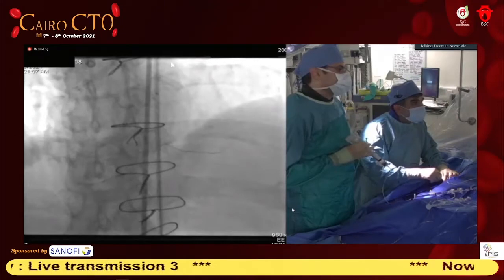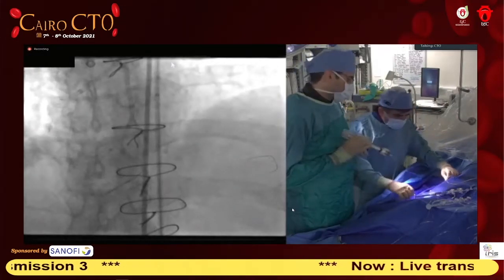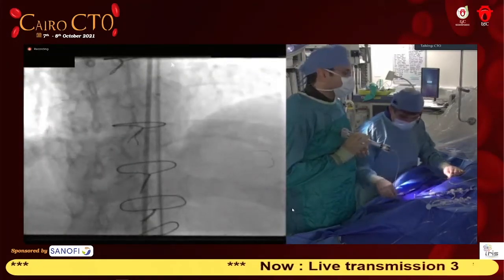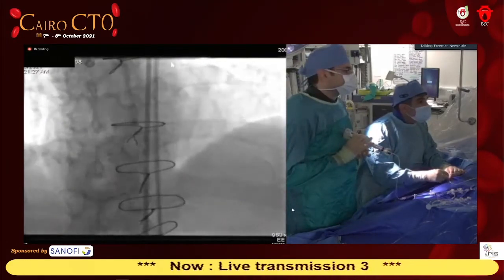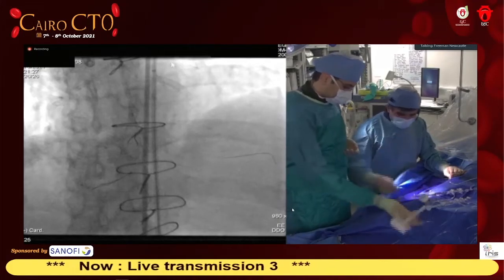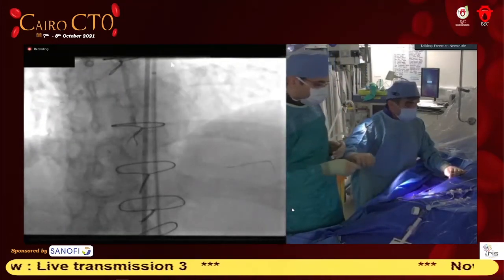It's taken all the branches now, but there we go. The distal, yeah, this is much better. Still have resistance? Okay. Yes, so I'm going to advance the guideliner on top. Hopefully this will go. I'm going to take the other wire out because there's no need for it anymore. Remove the other one. It's just hindering. Take that away.